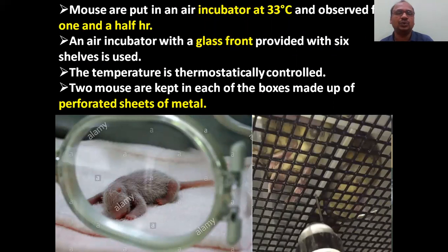Now, what you have to do: when you give an insulin injection, all the mice will undergo convulsions. It shows like this. Whenever there are convulsions, you have to note it down. That point is very, very important. Mouses are put in an incubator because we have told you, at elevated temperature. So all the mouse you have to put in an incubator at 33 degrees centigrade. You have to maintain that, it is nothing but elevated temperature. So insulin will start working and all the mice undergo convulsions. And you have to observe only 1.5 hours. Within that only convulsions will come. Okay, and you have to take a glass front.